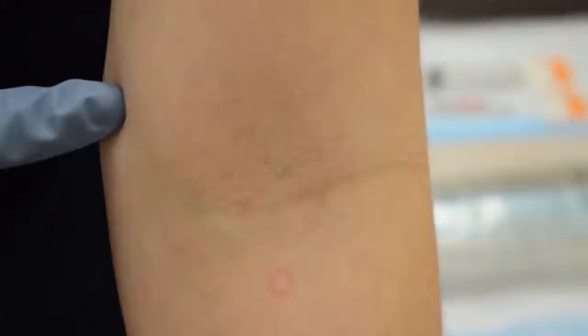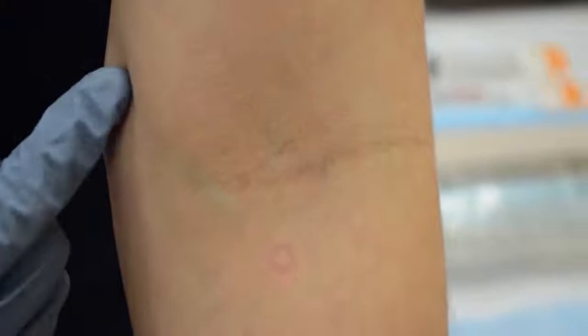We also want to make sure that we have enough of that vein available to us for the catheter to sit in. So you always want to feel where your vein starts and follow up your vein, feeling where it ends. You always want to start your IV at the point where your vein starts, so you can make sure you have enough room for your catheter to sit in, and therefore your IV is more effective and less likely to slip out.